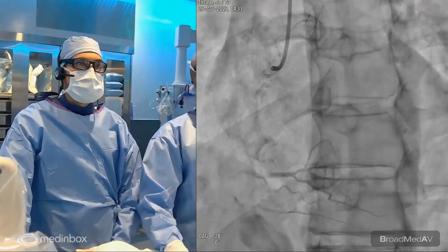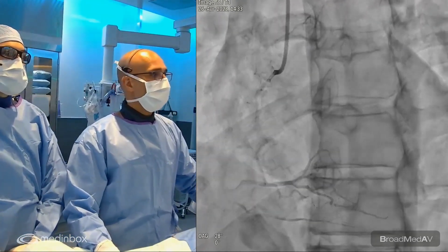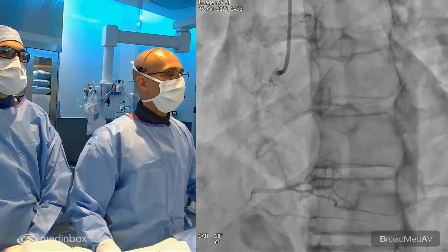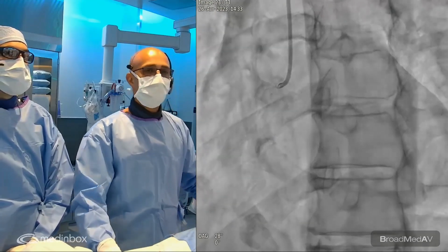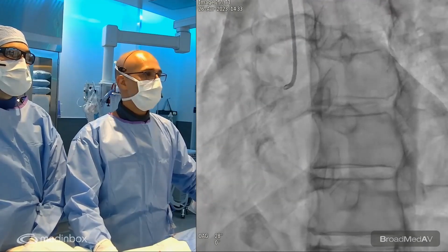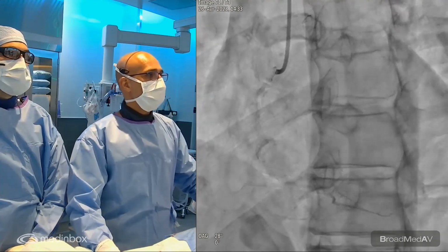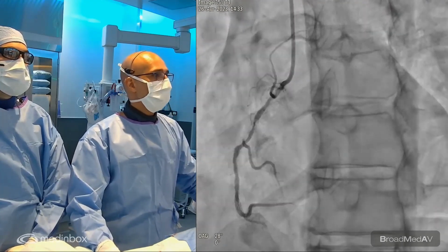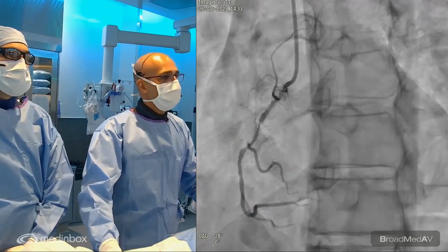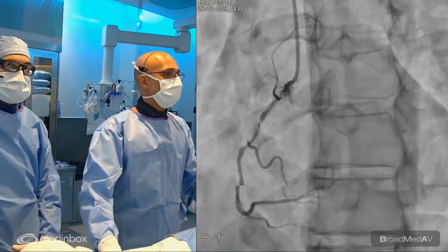And the plan of today, as Quentin went over, was to perform atherectomy of the RCA, followed by imaging to understand better the radiation-induced CAD that we have here and the extent of the calcification, because depending on what you see on imaging and IVUS, it will determine significantly how you need to modify plaque and what kind of therapies you need to use. So upon cannulation of the RCA, there was significant ventricularization. And as you can see before the injection of the dye, we can see a lot of calcium. But I think it doesn't give you a fair idea of what's going on in the vessel.